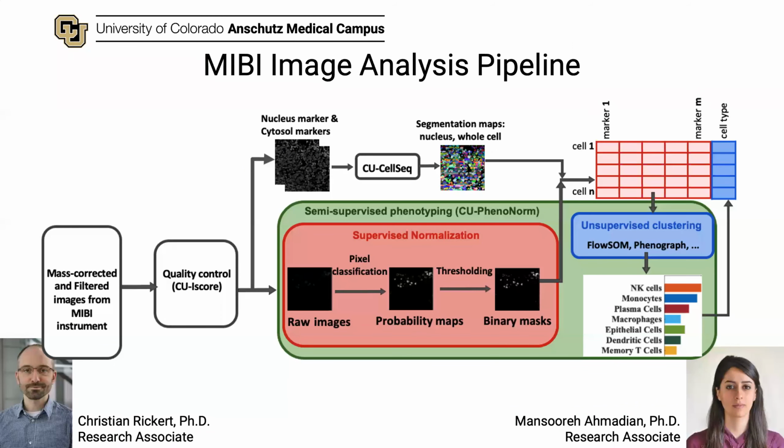The cells are less proliferative. So when we first ventured into MIBI, we knew that we were going to have an analysis problem. The software that we used for our Vectra Polaris pipeline is not open source and can only be used to analyze images that are collected on the Vectra Polaris platform. So being very familiar with that workflow, we were looking for a solution that would give us a similar type of result as what we get from Inform. So we're looking for single cell data where we can identify macrophages and T cells and B cells and some of the activation markers that those cells express as well.